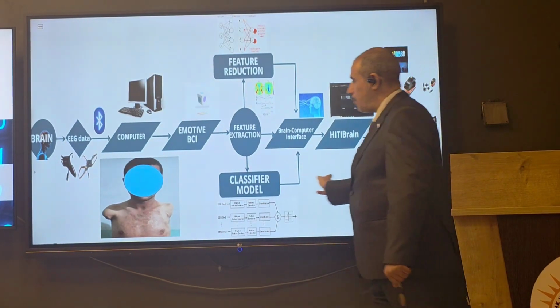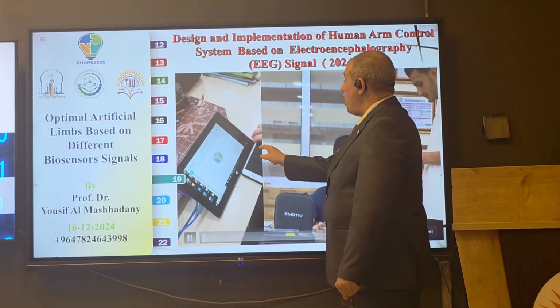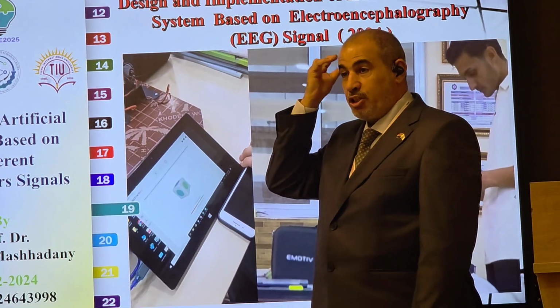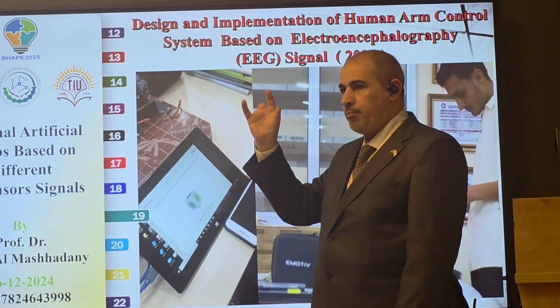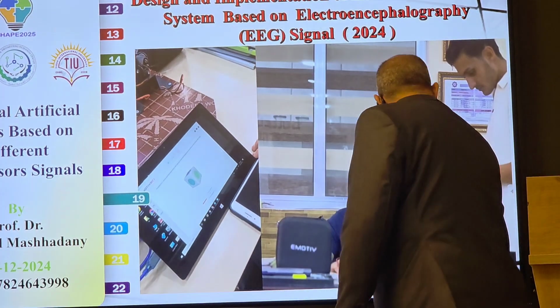All this is the step by step project. Look, this is real. At the beginning of the experiment, with Emotiv we trained the case study to control the cube by imagination, BCI, using some emotion, human moving it as required, and controlling it. Satisfactory.